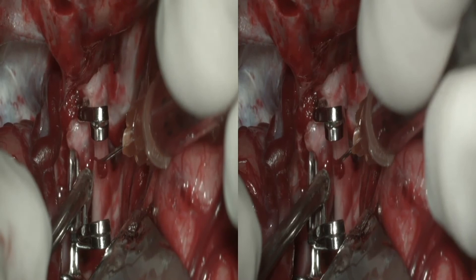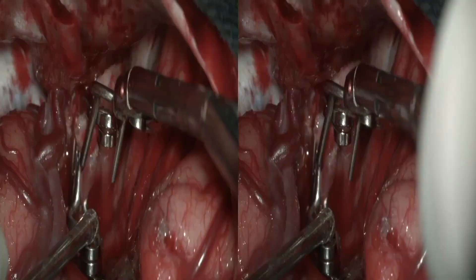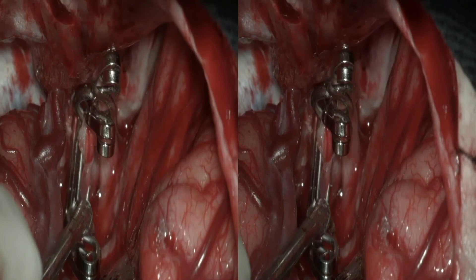A third and fourth clip were placed in tandem from the proximity to the internal carotid artery to the dome of the aneurysm in order to collapse the aneurysm walls. Finally, a fifth curved clip was placed on the previous ones to give them greater closing pressure.